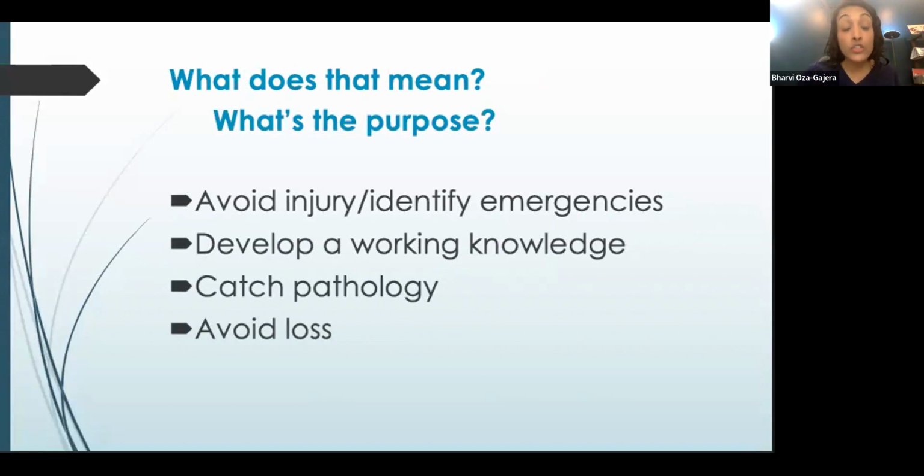So honestly, we're trying to avoid cannulation injury. So avoid any injury that occurs with the needling of that access. And the best way to do that, that's been studied, is to do these 1-minute checks. It's a quick assessment of the patient's access before you actually try to go and stick that patient. The reason we want to avoid cannulation injury is because oftentimes, once someone has an injury, their access is changed. Not always permanently, but quite often.